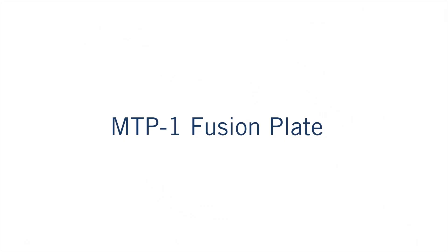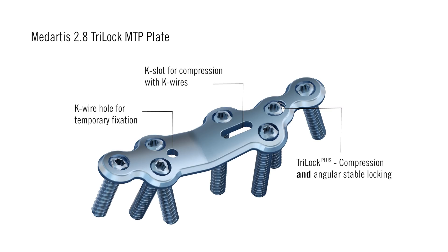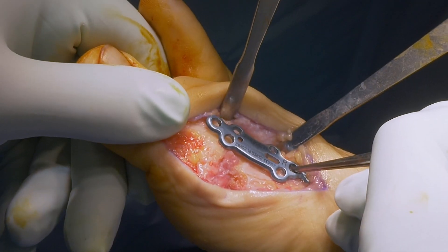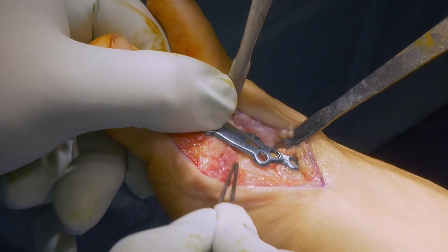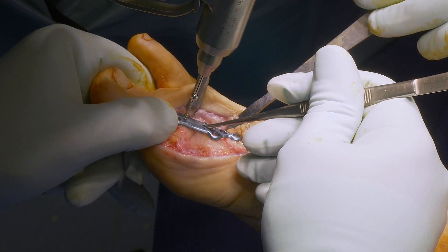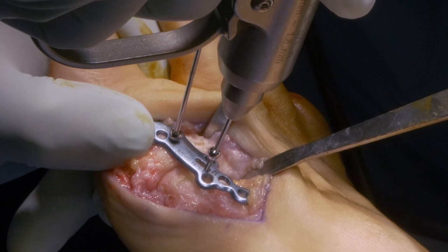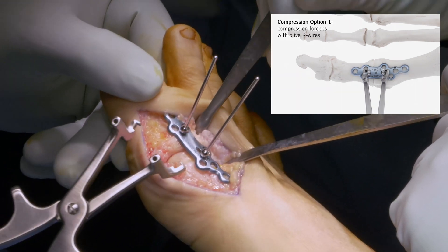MTP-1 fusion plate: The Medatis 2.8 Triloc MTP plate with 0-degree dorsiflexion angle is used. The plate is positioned on the dorsal side and should not be placed too proximal or too distal — it should sit exactly centred over the fusion area. Fix the plate preliminarily with olive K-wires.